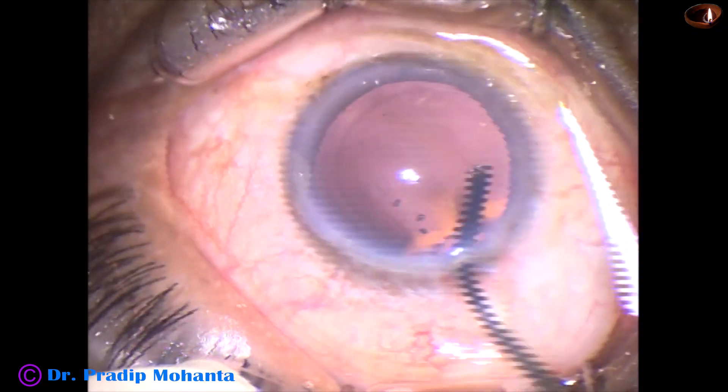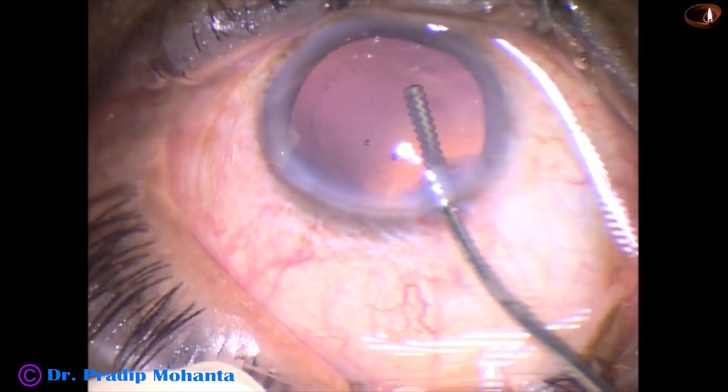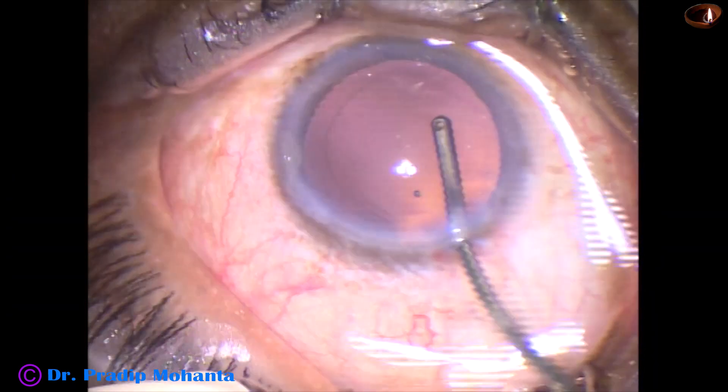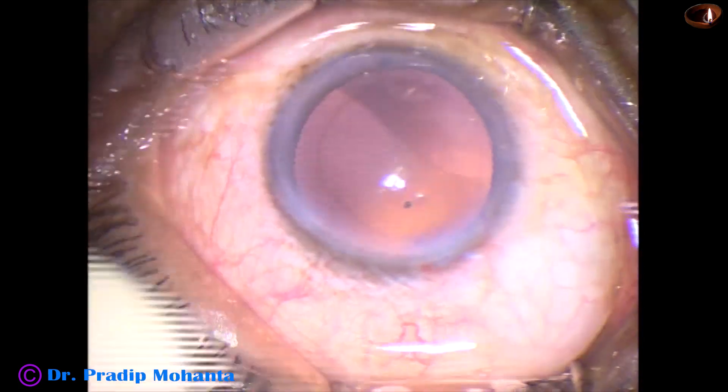Now, this is hydropolish. Some cells sticking to the posterior capsule are removed — lens epithelial cells.